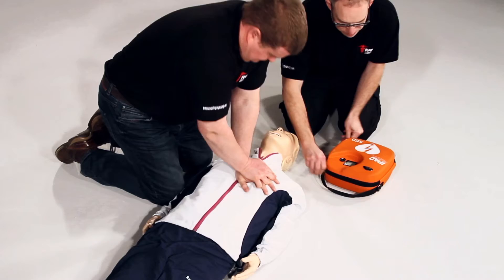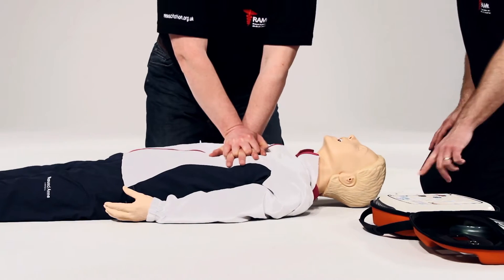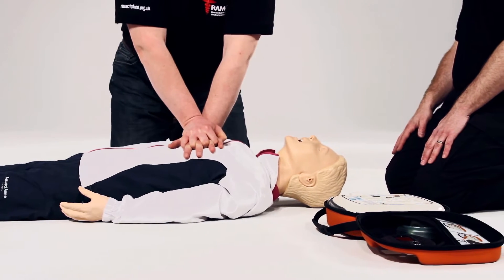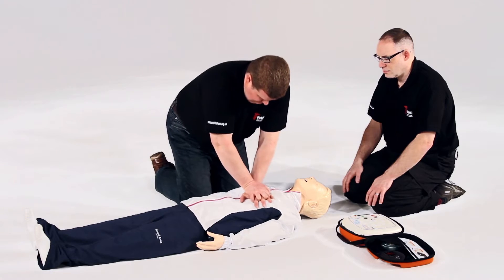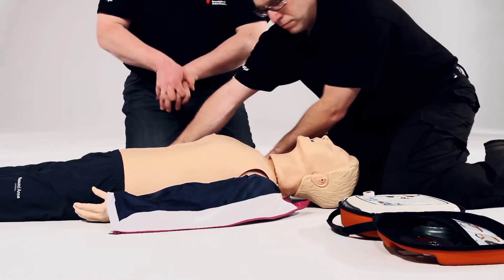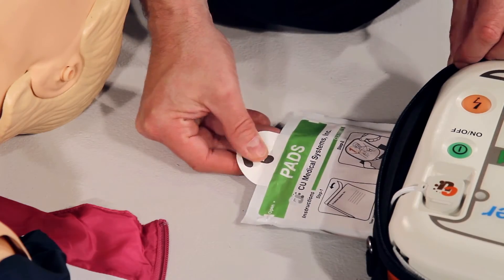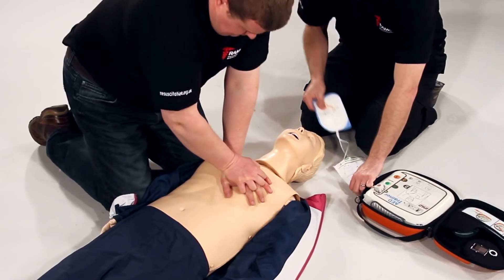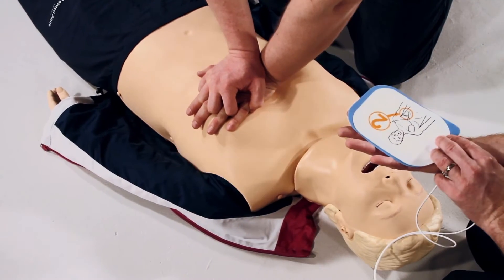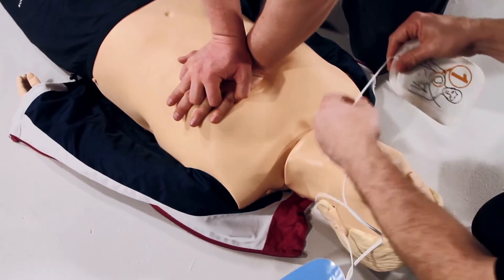You carry on, I'll work around you. Adult mode. Follow the voice prompt calmly. Remove all clothing from chest and stomach — rip clothing if necessary. Tear open the pad's packaging. Look closely at the picture on each pad. Peel off the pad labelled 1 and stick to the bare skin of the patient, exactly as shown in the picture.